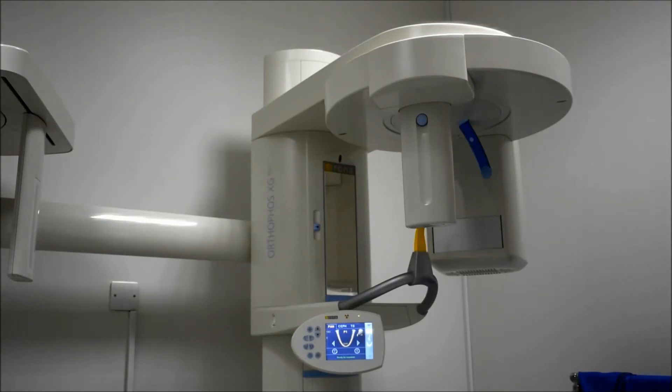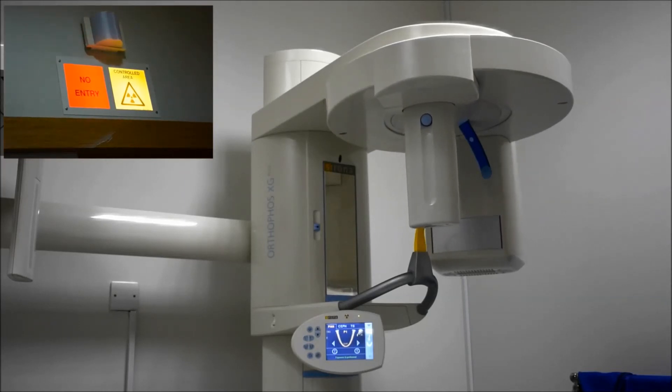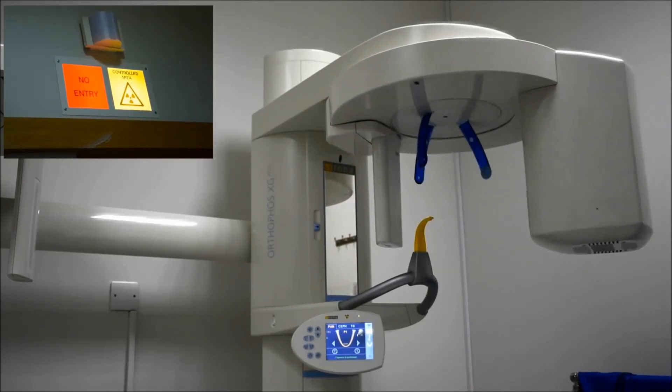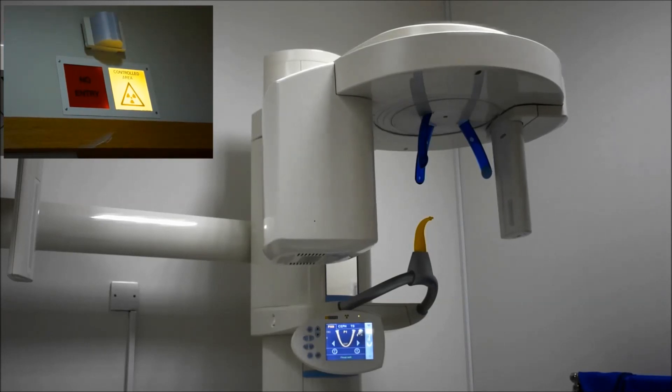Just like any other x-ray machine, when real x-ray is being generated, you will always hear a sound and see a light indicating that x-ray is being produced. When I click the exposure button — just as in the T test mode — the machine will start rotating in exactly the same manner as it would during a normal exposure, rotating almost 270 degrees all around, and then it will stop with a typical stopping sound.